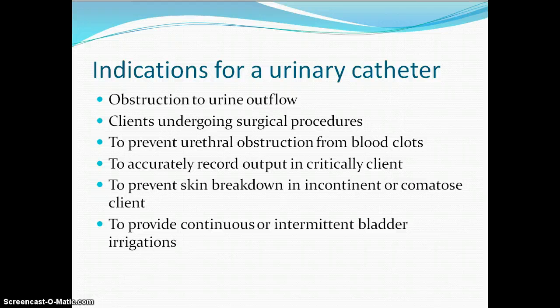One reason that we would want to put a catheter in is the number 2 bullet for surgical procedures. The very simple fact that we want that bladder very small without urine so that it is not nicked or damaged during the surgery to the abdomen. Women going in for an emergency C-section, same reason. We want to get that bladder as small as possible so that it is not damaged.